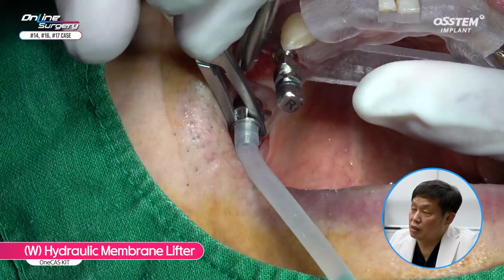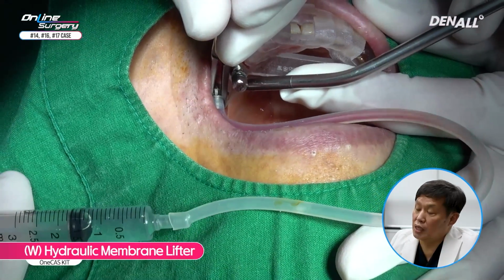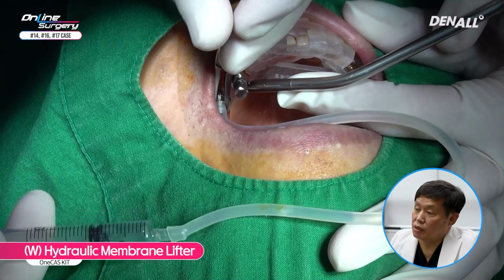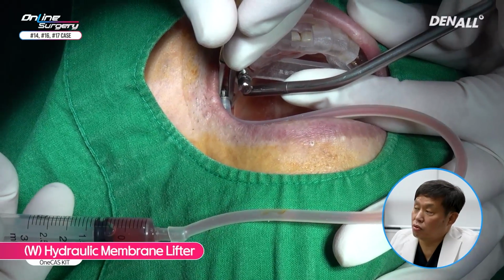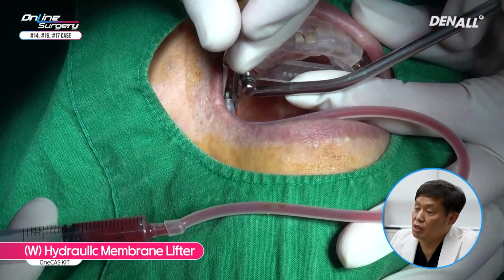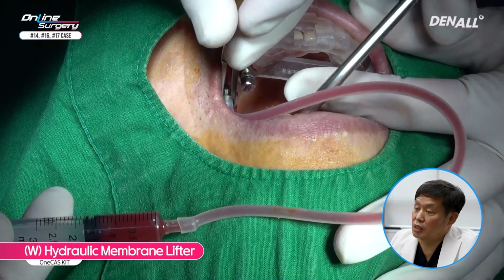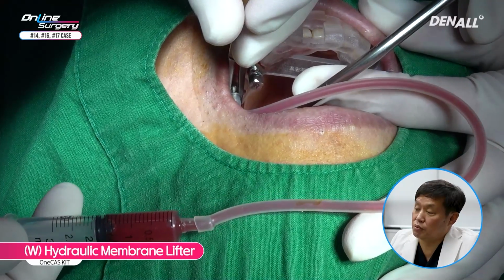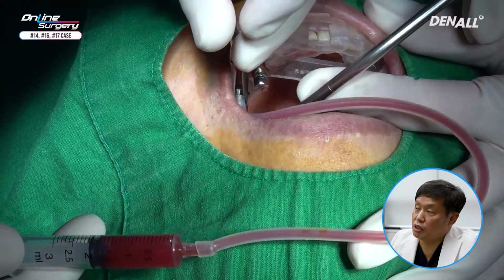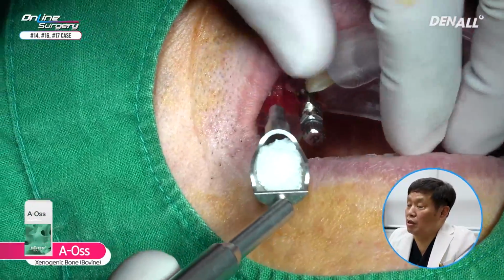Hydrolift was performed thereafter. In 3 cc syringe, using 0.5, gradually aspiration was performed. There's no air and there's negative pressure, so you can assume that sinus membrane was lifted without damage. Negative pressure was formed and sinus membrane was lifted.